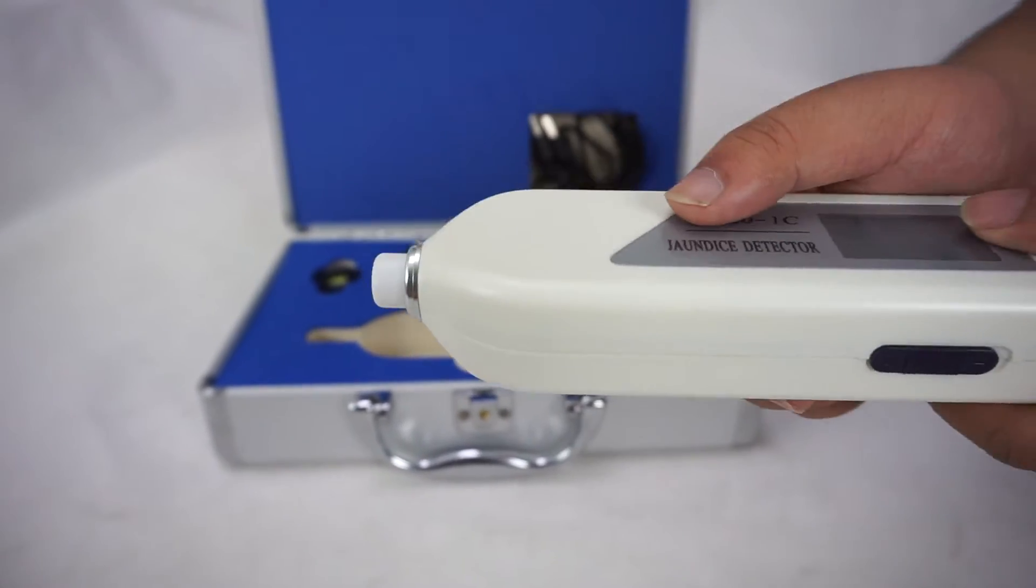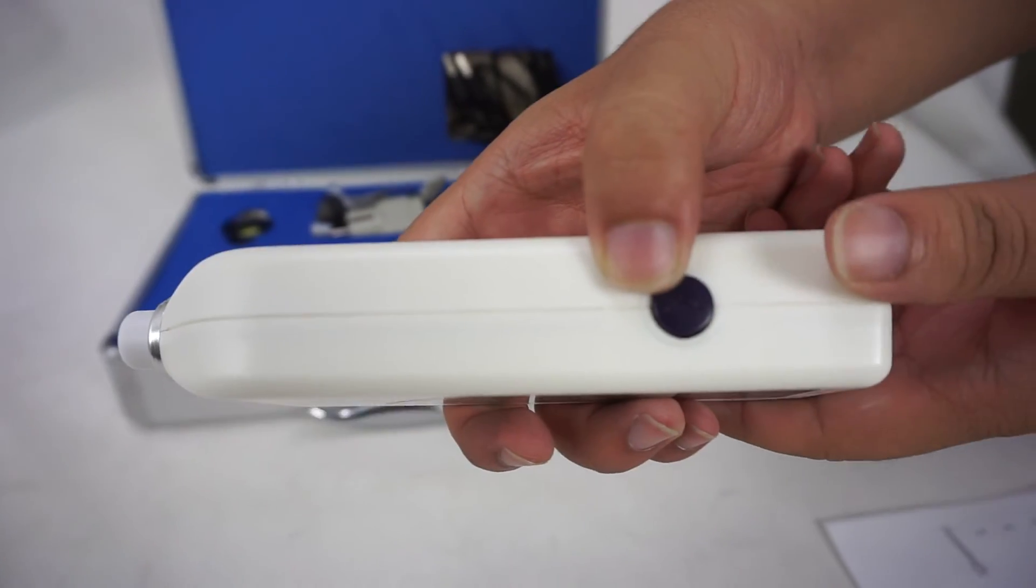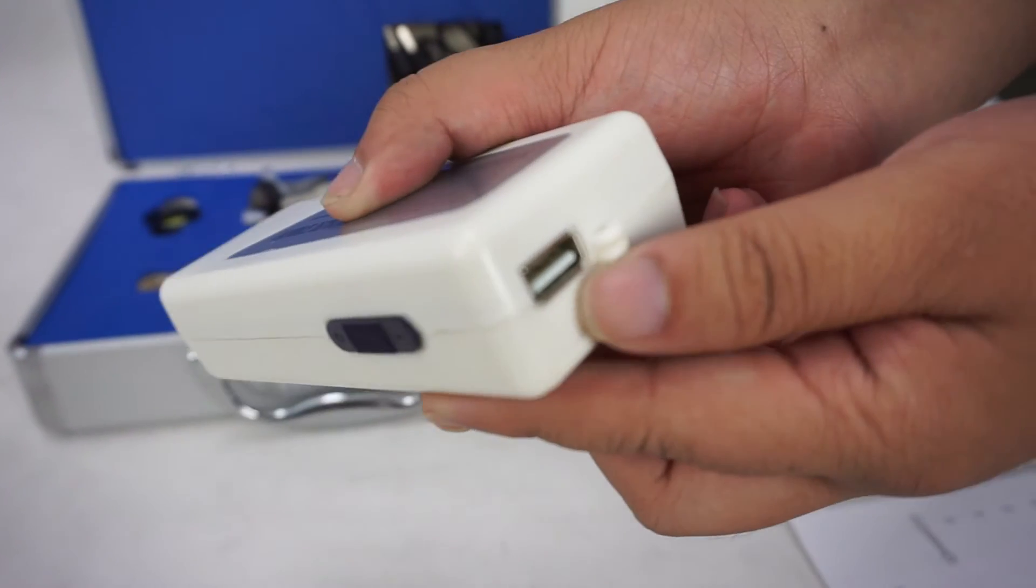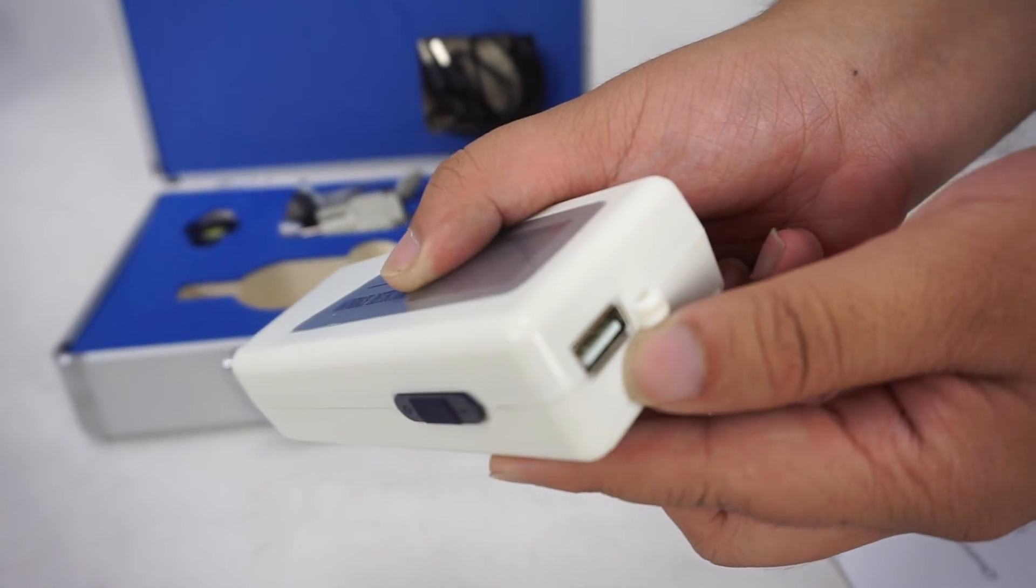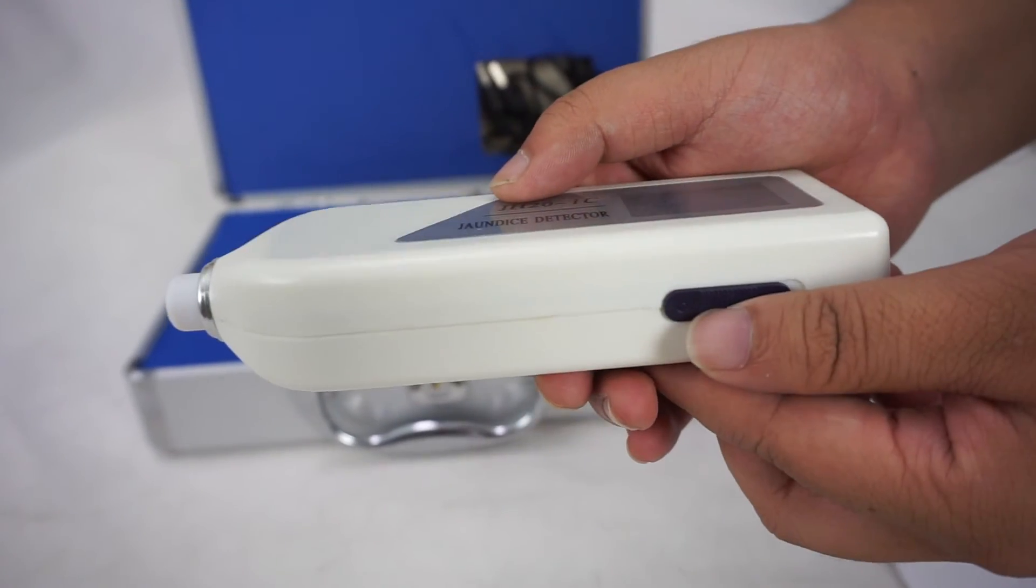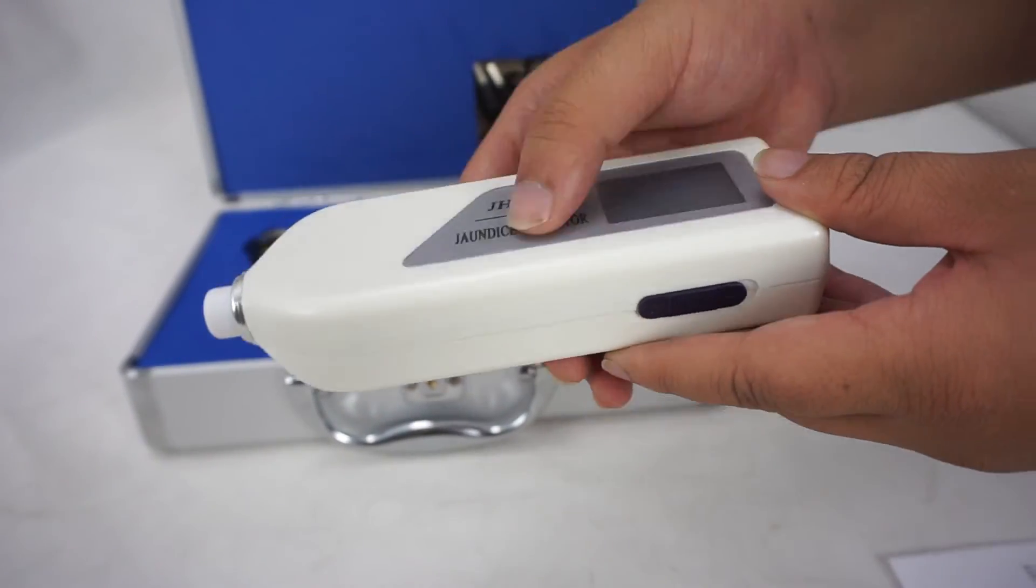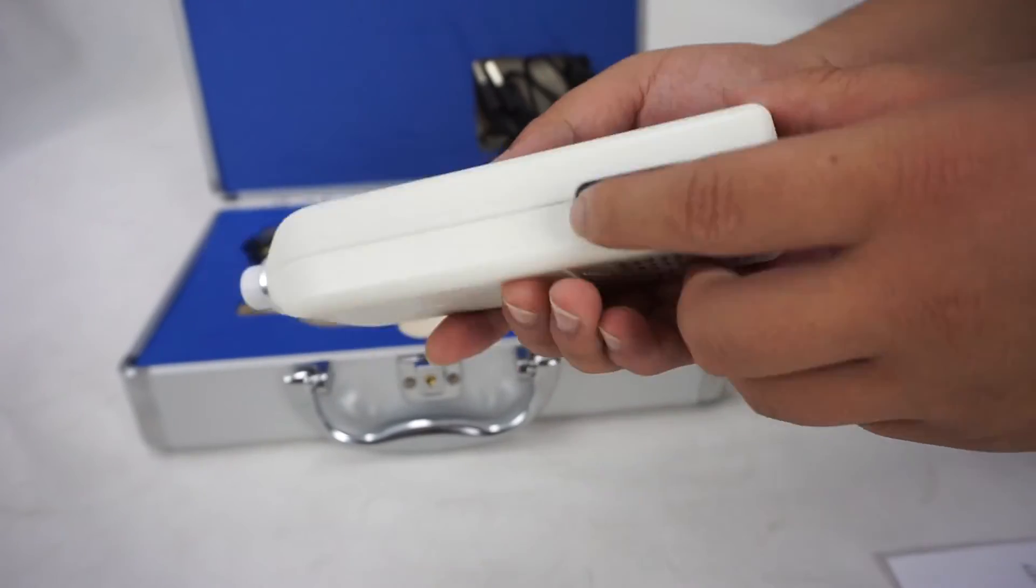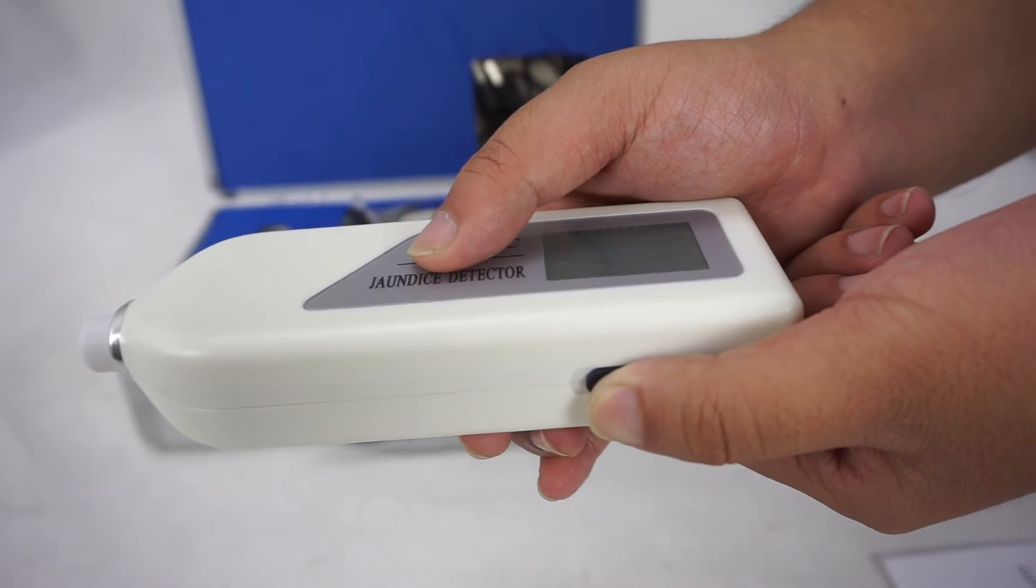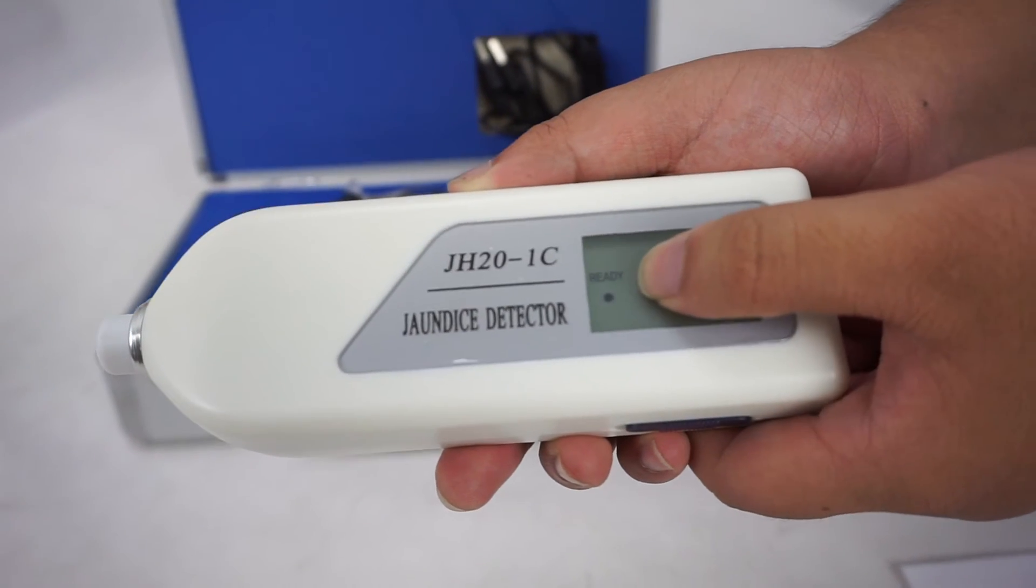The machine has a measuring probe, reset button, and USB interface. And before using the machine, you should check the machine if it is working or not. Let the machine turn on. You will see the ready indicator light.